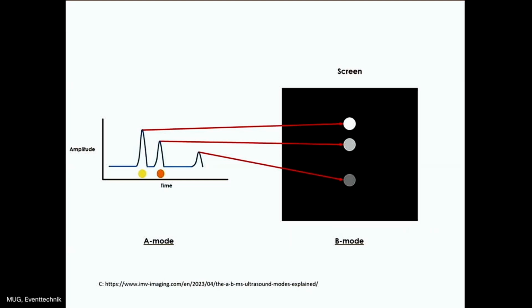And these were actually the first ultrasound images we had, diagrams of amplitudes, so-called A mode. Later on, this was translated into a grayscale depending on the intensity. And if you align a lot of these crystals, and you have these different grayscales, you get a B mode, brightness mode picture. The picture everyone knows from ultrasound imaging every day.